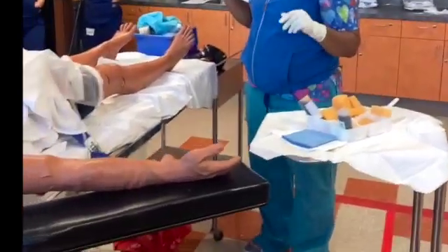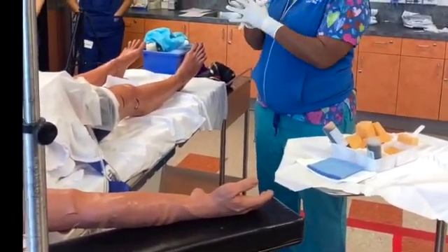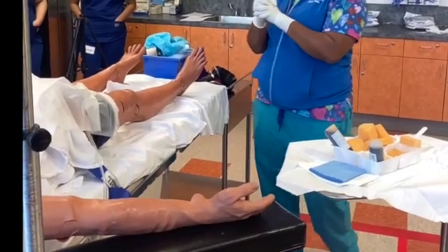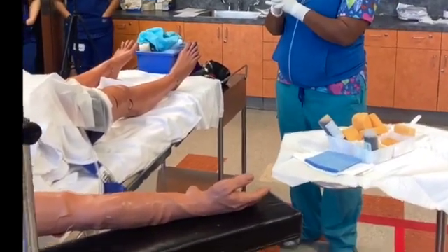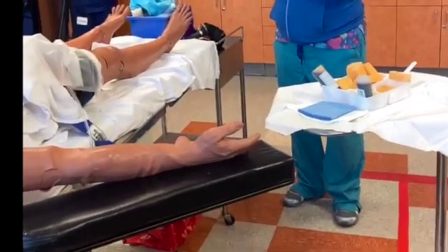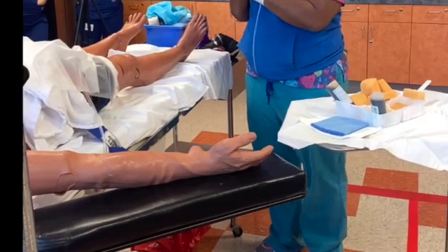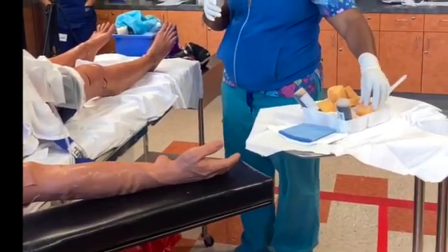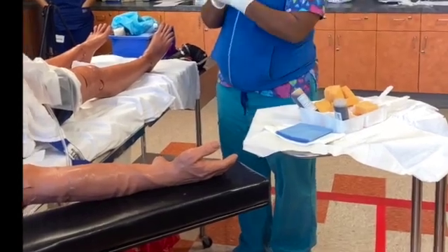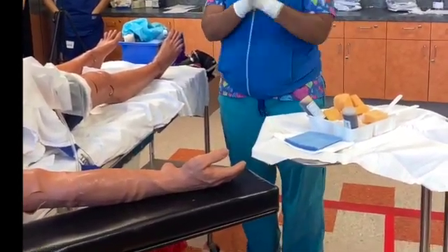Okay. Student checks surgeon's order for prep solution tincture, checks patient charts for allergies, takes appropriate action if allergy or prep solution or latex are documented in the chart. Okay. Sends prep supplies, prepared sterile field on prep table as needed. Opens sufficient number of prep applicators used or pours antiseptic solution in a small basin. Performs hand antisepsis. What you guys saw me do before I even came over to my room.